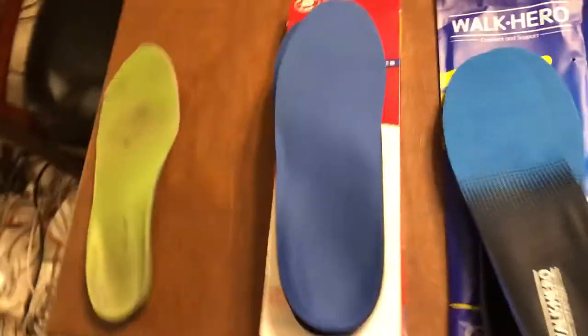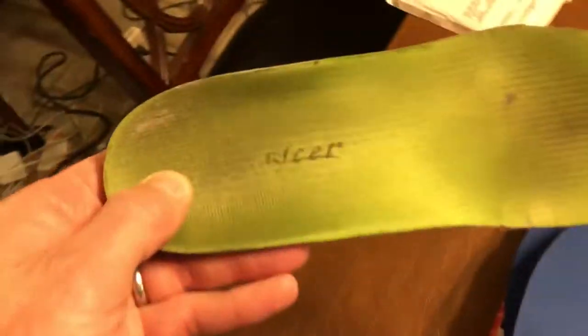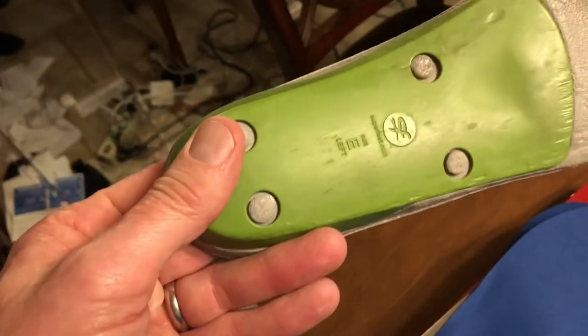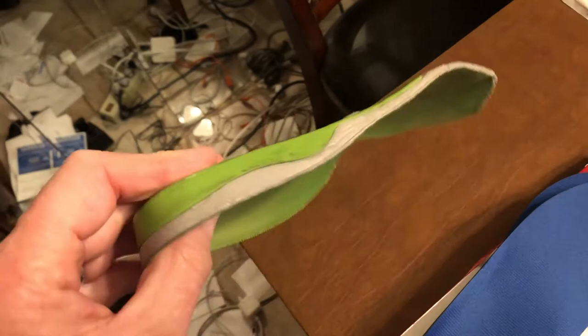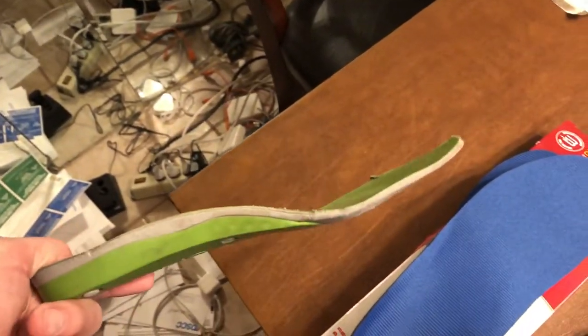A quick review of substitutes for Superfeet orthotic inserts that you can buy on Amazon for less than 20 bucks. This is an old set of Superfeet that I've worn the heck out of — probably gonna keep using them. They were probably somewhere in the neighborhood of 37 to almost 50 bucks for a pair.